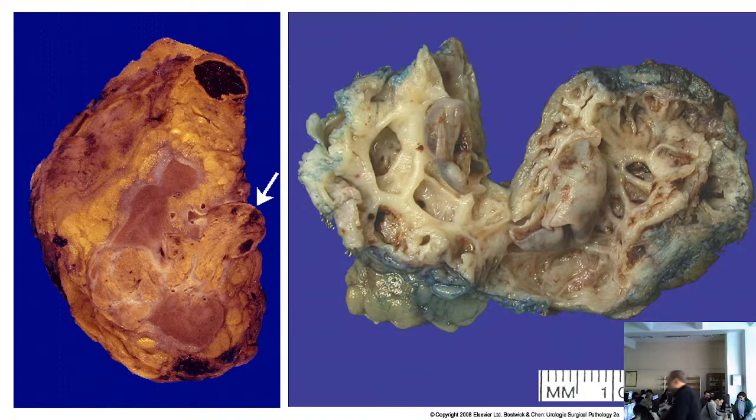And what do we see in the right image? We see multiple septa dividing a tumor with cystic formation. It's what I said previously, that when we have a cystic lesion in the kidney, we have to look whether its inside architecture is complex or not. Here it is, of course, too complex because you can see all these septa dividing the cystic spaces. You see all this cystic consistency of the tumor?